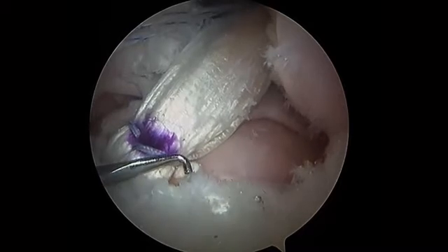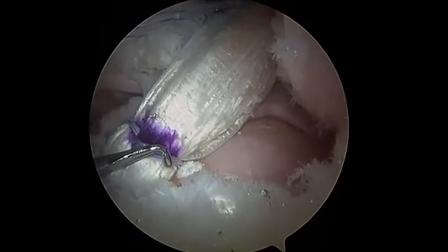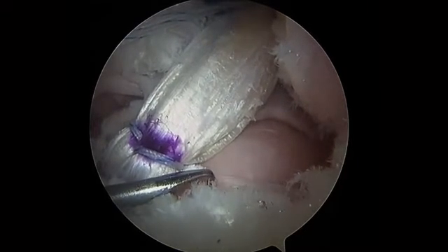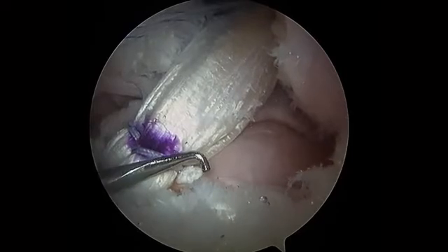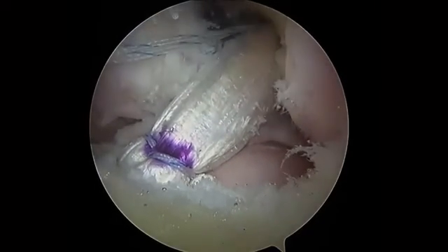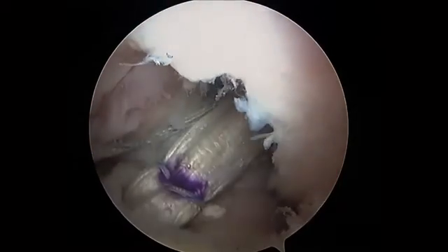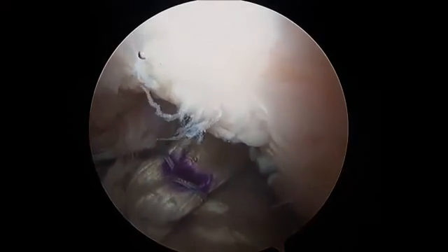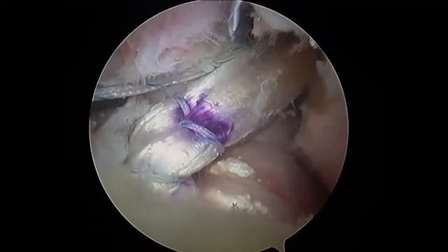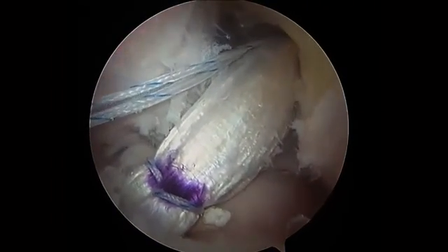Okay, so this is our final graft position. We can look at the isometry. Look at the suture here and note its relationship to the anterior horn of the lateral meniscus. We'll see how much length change there is through the range of motion. So let's go ahead and extend the knee. Not a lot. Couple millimeters or so of length change through that range of motion.